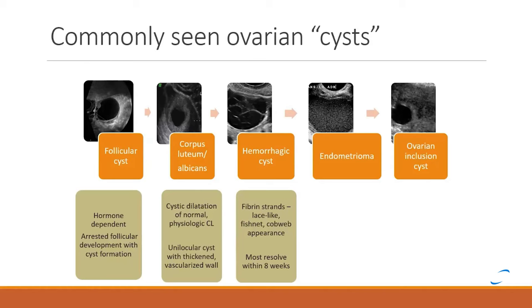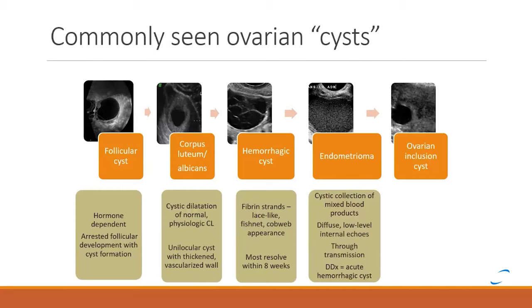The hemorrhagic cyst is usually quite characteristic on ultrasound. It tends to have the appearance of a cobweb or lace-like configuration with lots of fibrin strands, and there's an angular clot that you can see retracting, outlined with very angular and straight margins. That's what a hemorrhagic cyst looks like, and most of those resolve within eight weeks.